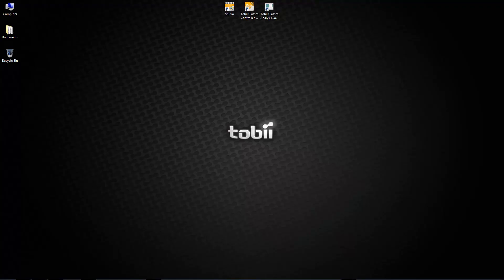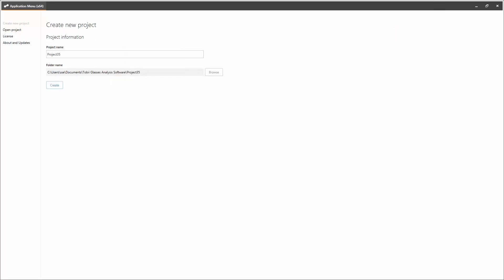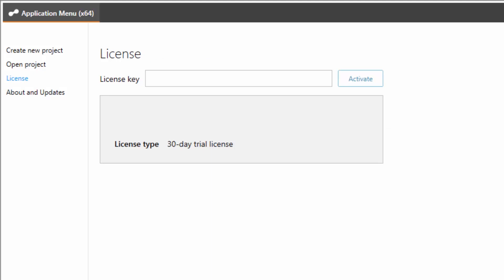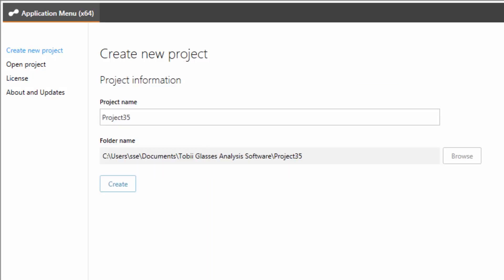Now that we have collected our data with Tobii Glasses 2, we can analyse it in Tobii Glasses analysis software. Please install the software on the Windows device you intend to use and then open it. The software has to be purchased separately or it is included in the premium and subscription packages of Tobii Glasses 2. You will need a valid license key to install the software, which you can find in the product purchase email. First, we need to create a new project. Choose a name and where you want the project to be saved and click create.